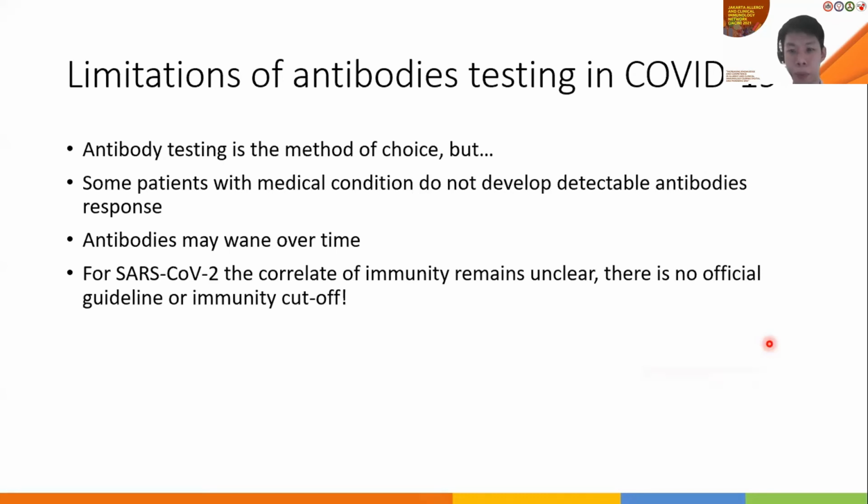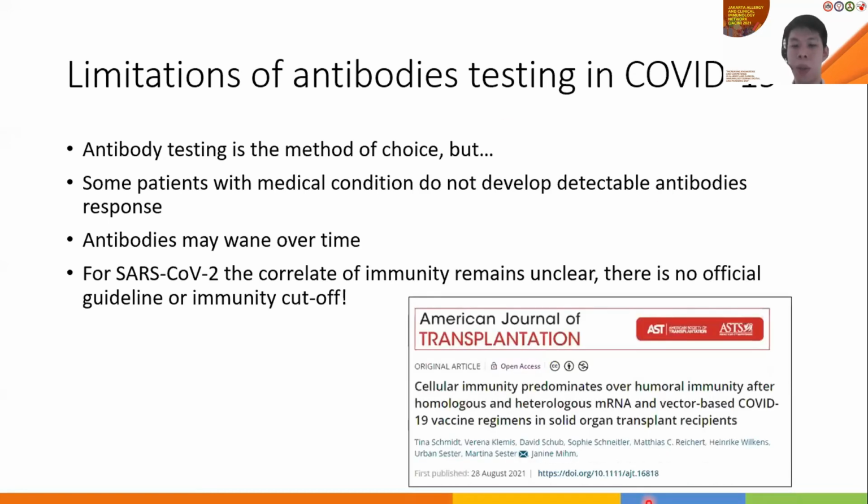So at EUROImmune, we have seen reports of cellular immunity showing that patients on solid organ transplant or immunosuppressant therapy do have cellular immunity that provides them some form of protection in their cell-mediated immune arm after vaccination, with either the mRNA vaccine or the vector-based COVID-19 vaccine.